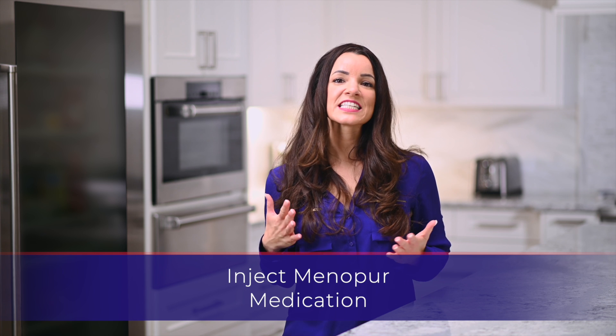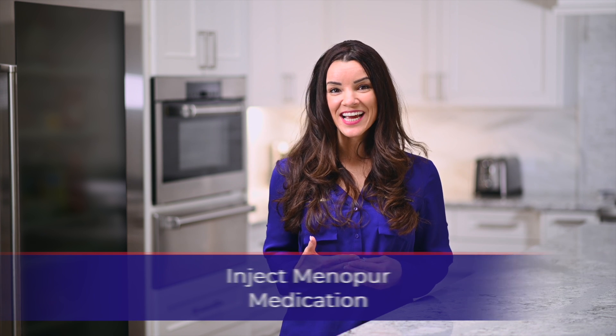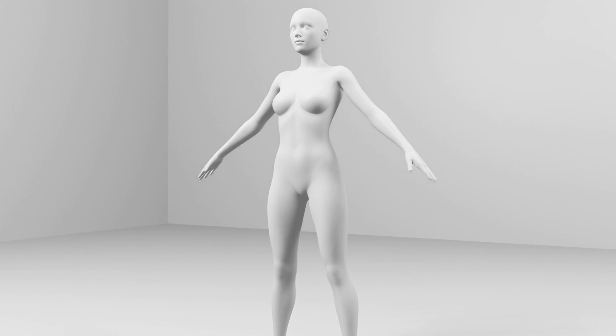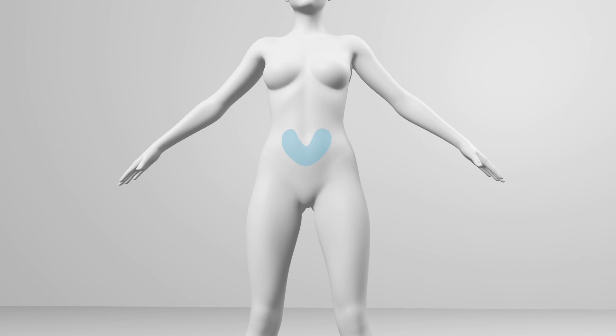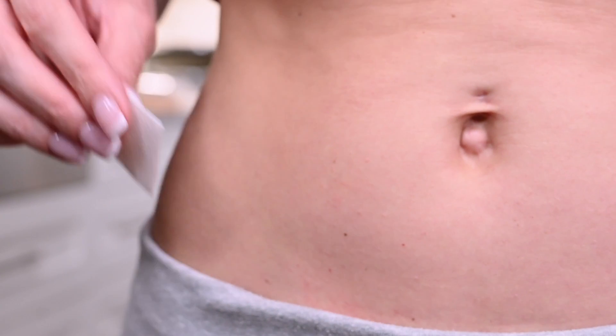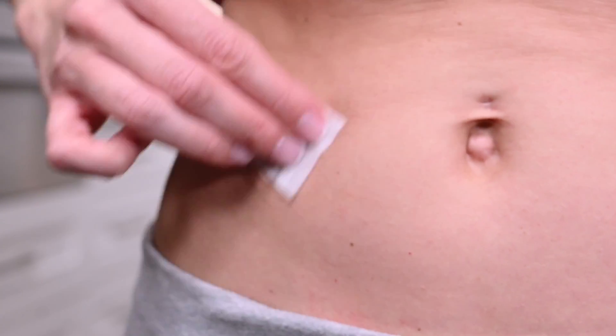The injection is administered in a subcutaneous site specified by your physician. The most convenient site for a subcutaneous injection is in the abdomen around the navel. If your physician has specified that you are to administer this injection differently — for example, intramuscularly — please proceed as directed by your doctor or nurse. Wipe the injection site with an alcohol prep wipe and allow the skin to dry. Make sure to alternate the injection sites between both sides of your body.